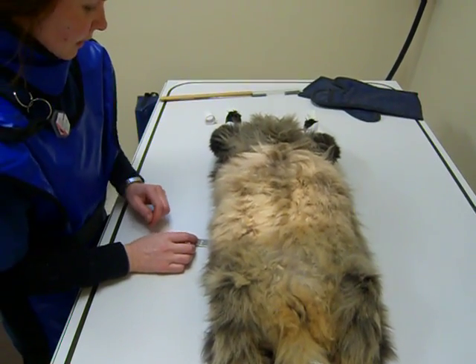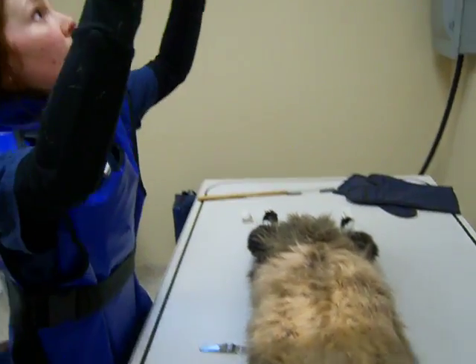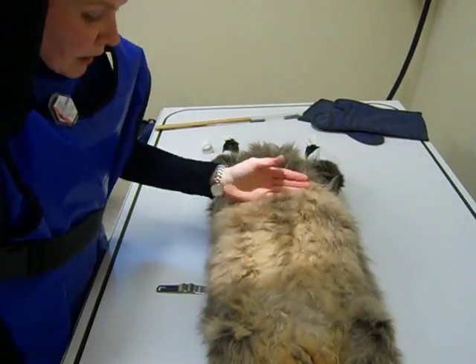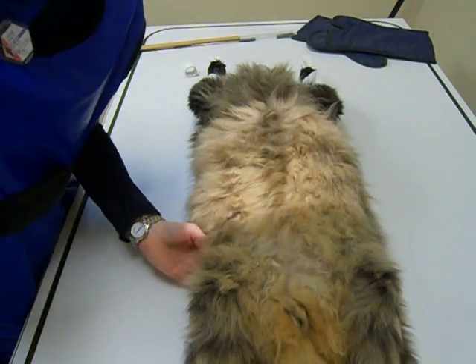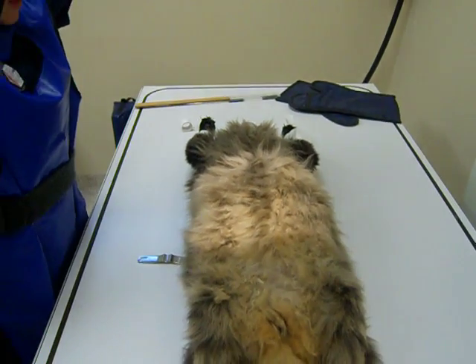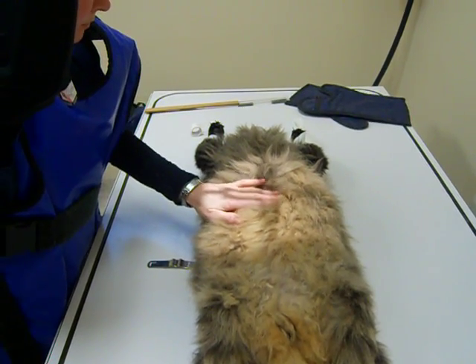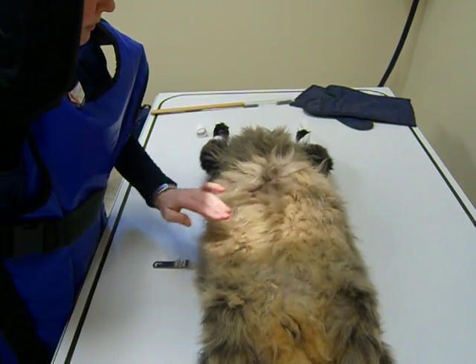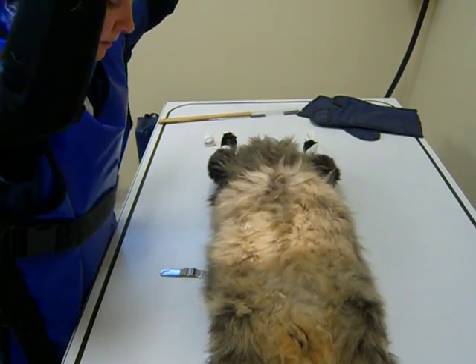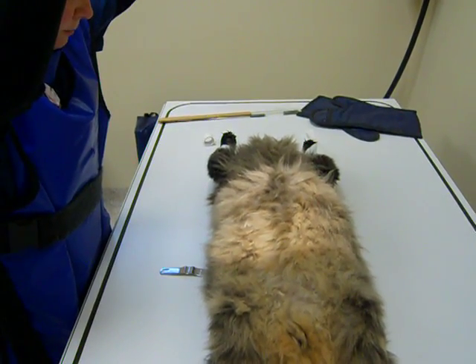We'll make sure our right marker is on the right side and we'll collimate from the diaphragm to the femoral head. Our X-ray beam will be 2 to 3 finger spaces from the 13th rib, and we will take the X-ray on expiration.